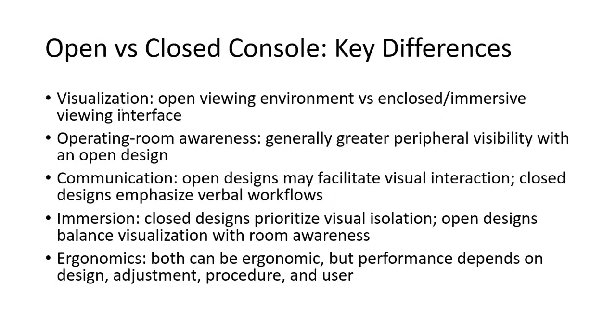So that was the discussion about what an open console is, and there are key differences between the open console and the closed console. In the next lecture I will discuss the comparison of the closed console and the open console.